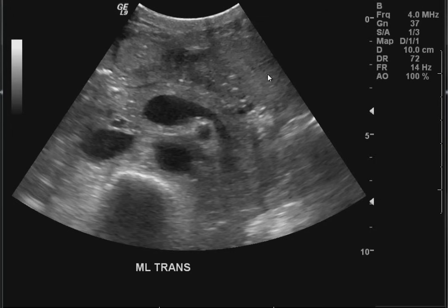Good morning, Dr. Madrazo here. This is a transverse view of the epigastric area.